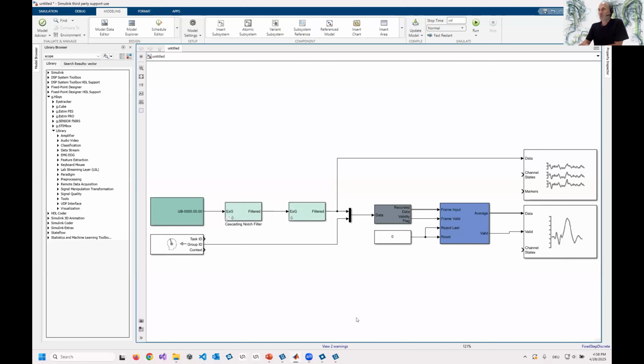Is it HiSys or HIS? It's HiSys for high channel count system and high-speed online processing. This was actually the original name, high-speed online processing.